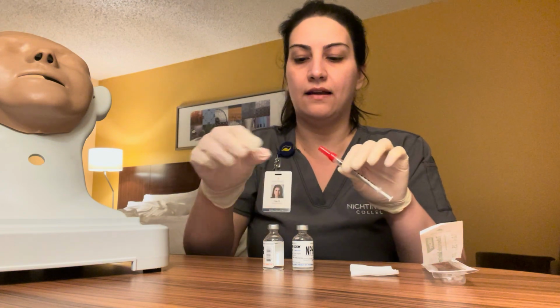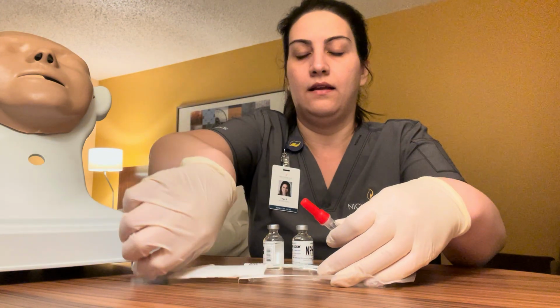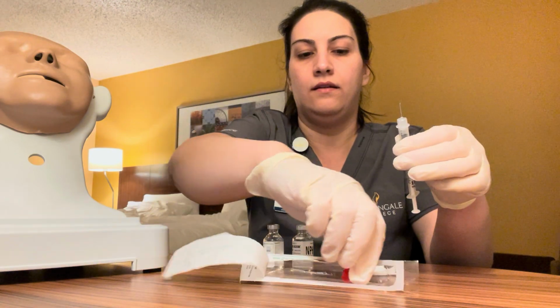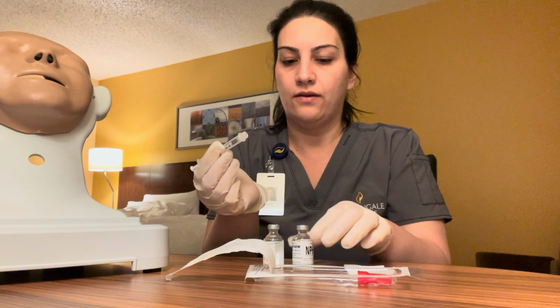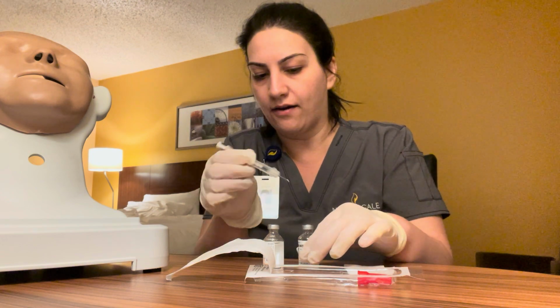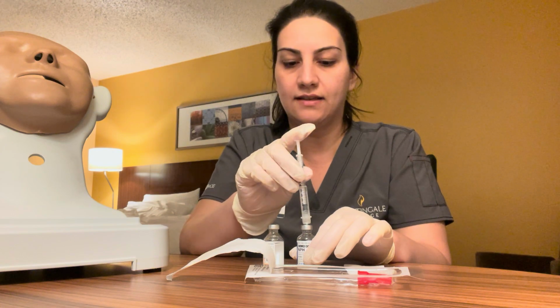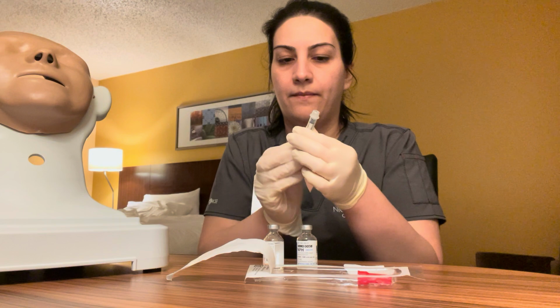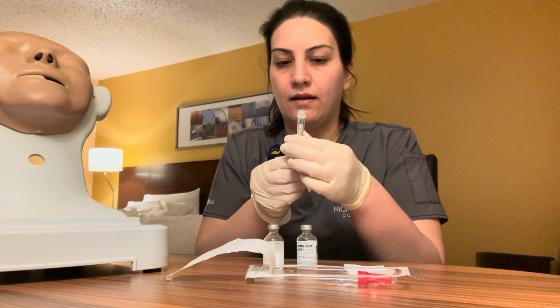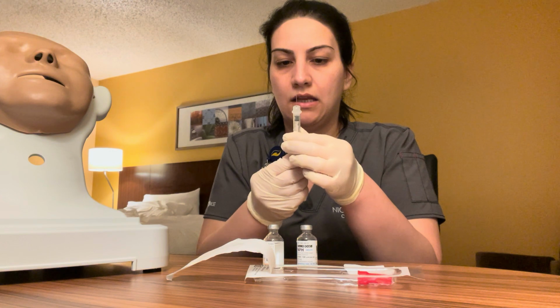I'm going to take off the cap. Use this for a scooping method later. So we're going to inject the air into the intermediate, not drawing up any of the solution. Next, we're going to get the air of the regular insulin.